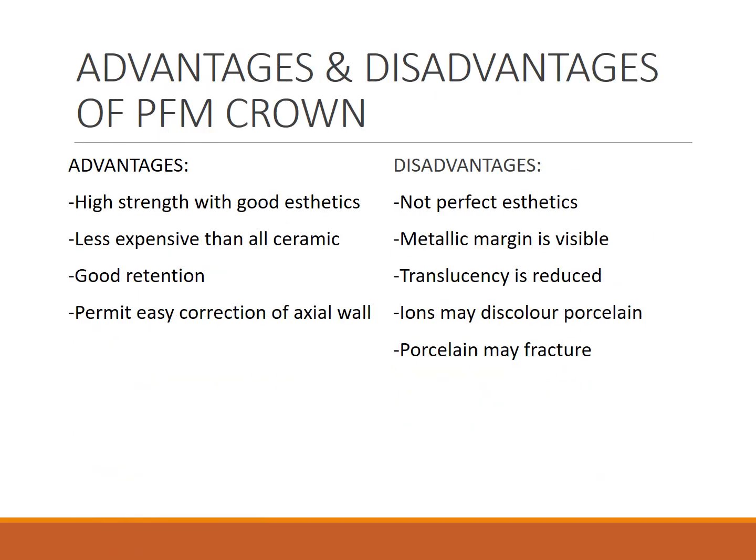Okay, coming to the advantages: high strength with good aesthetics, and less expensive than an all ceramic crown. It provides good retention. It permits easy correction of axial wall. Disadvantages: not very perfect, meaning it has good aesthetics, but it's just not the perfect one.